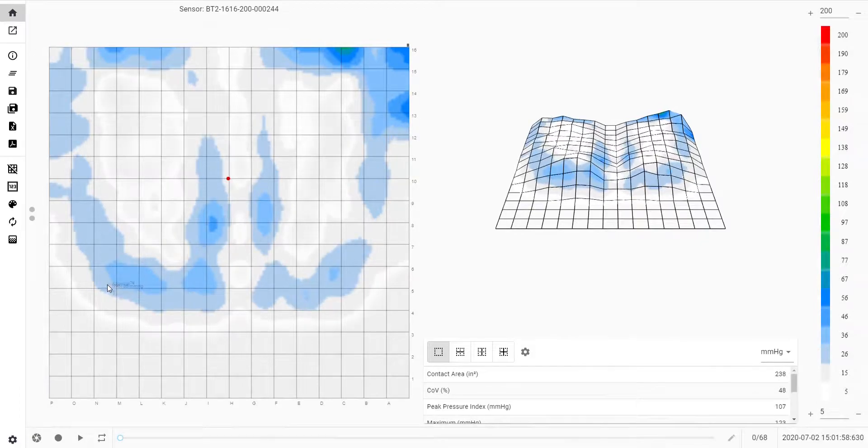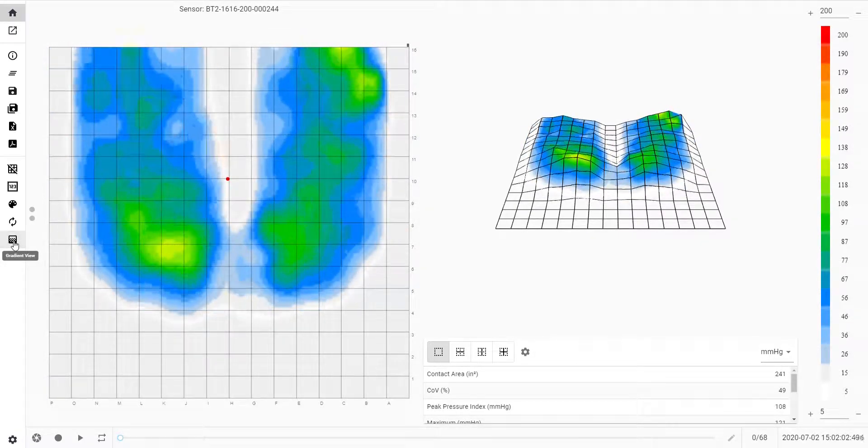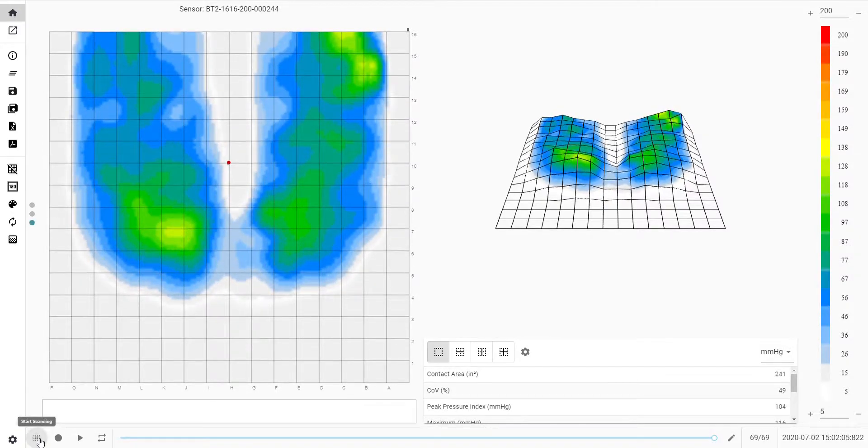The gradient view shows the potential risk of shear forces. Snapshots can be saved with notes as PDF or Excel, making them simple to email without the need for software.